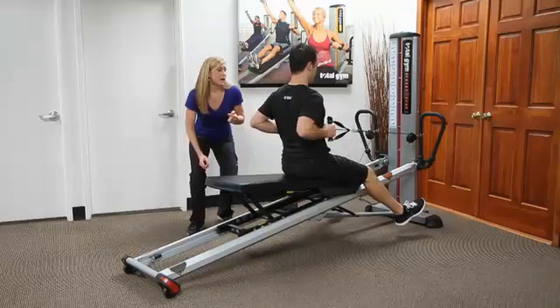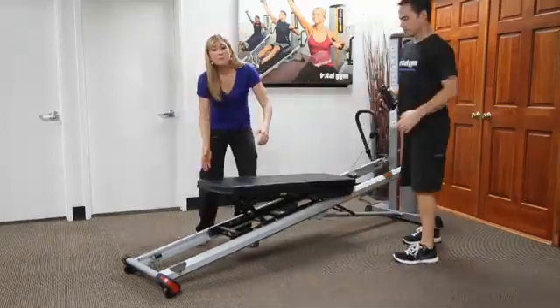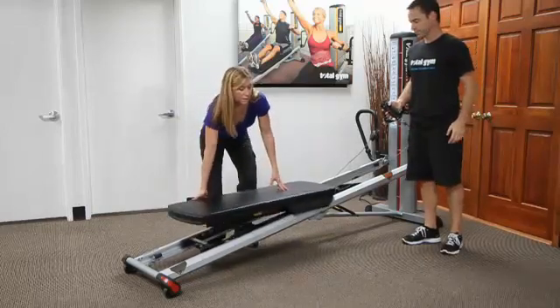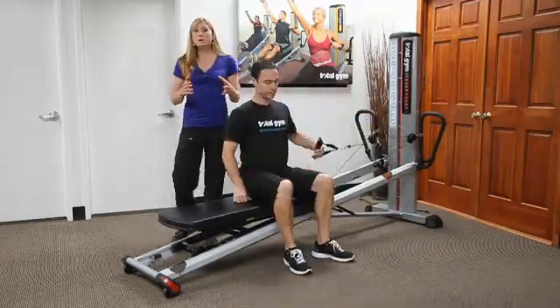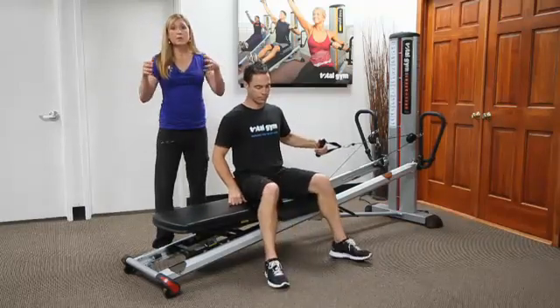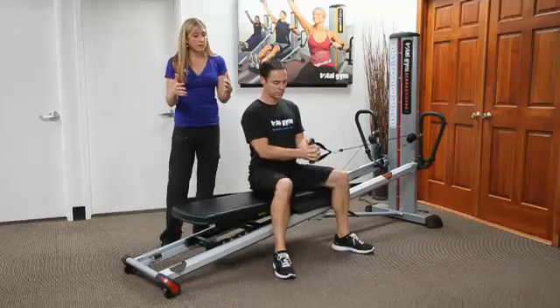So moving on from that, I'm going to have you anchor down and stand up. The glide board comes to a parallel position. So when someone is seated lateral, for instance, I'm going to have you go into a torso rotation, and we'll use one handle for this. He'll anchor down. People don't know what to do with their legs. So I have people start with a widened base of support with their feet down on the ground, so they're self-spotting and giving themselves more stabilization.